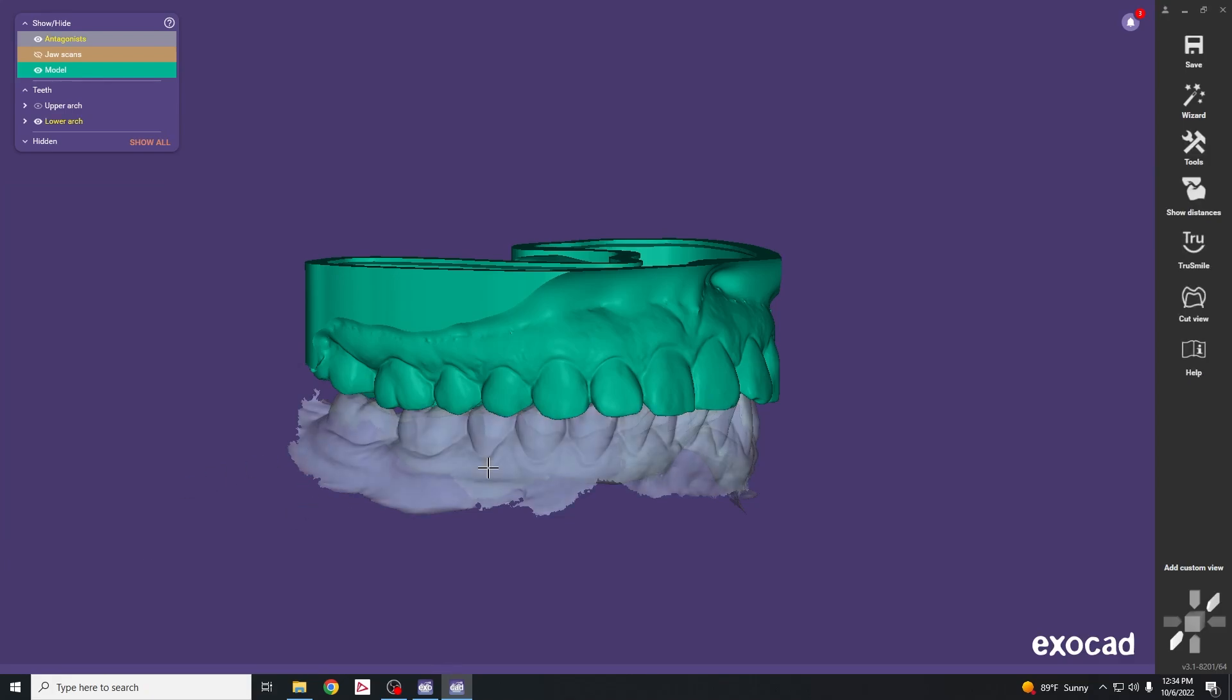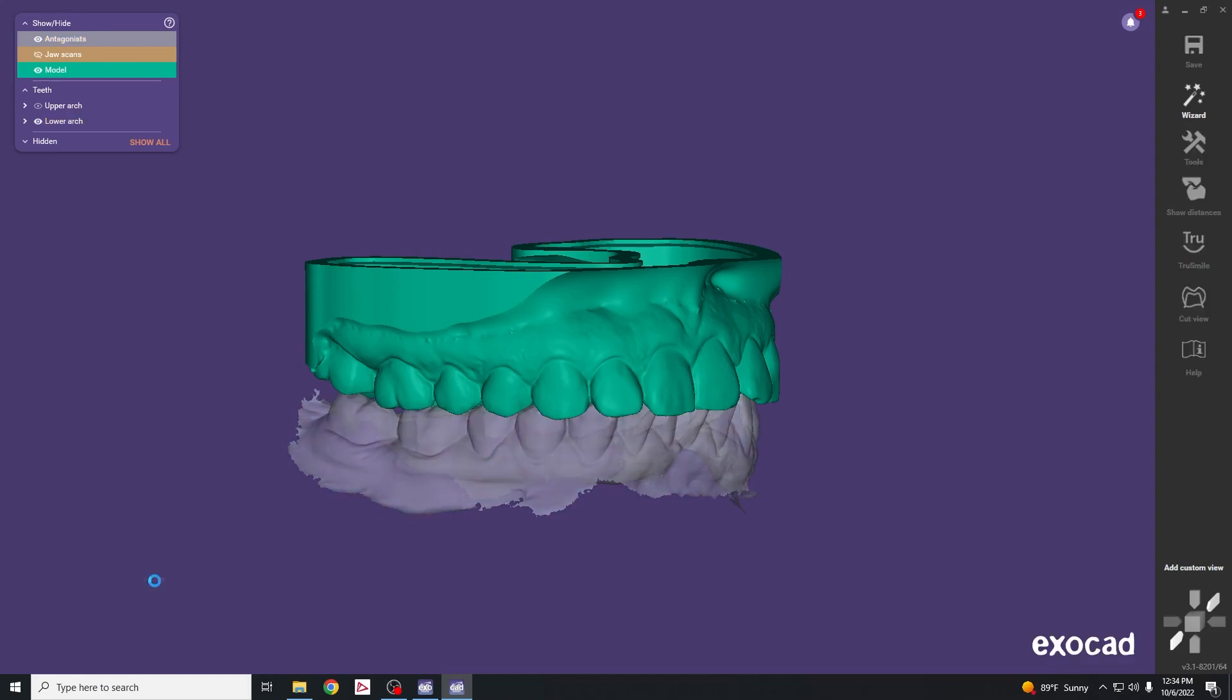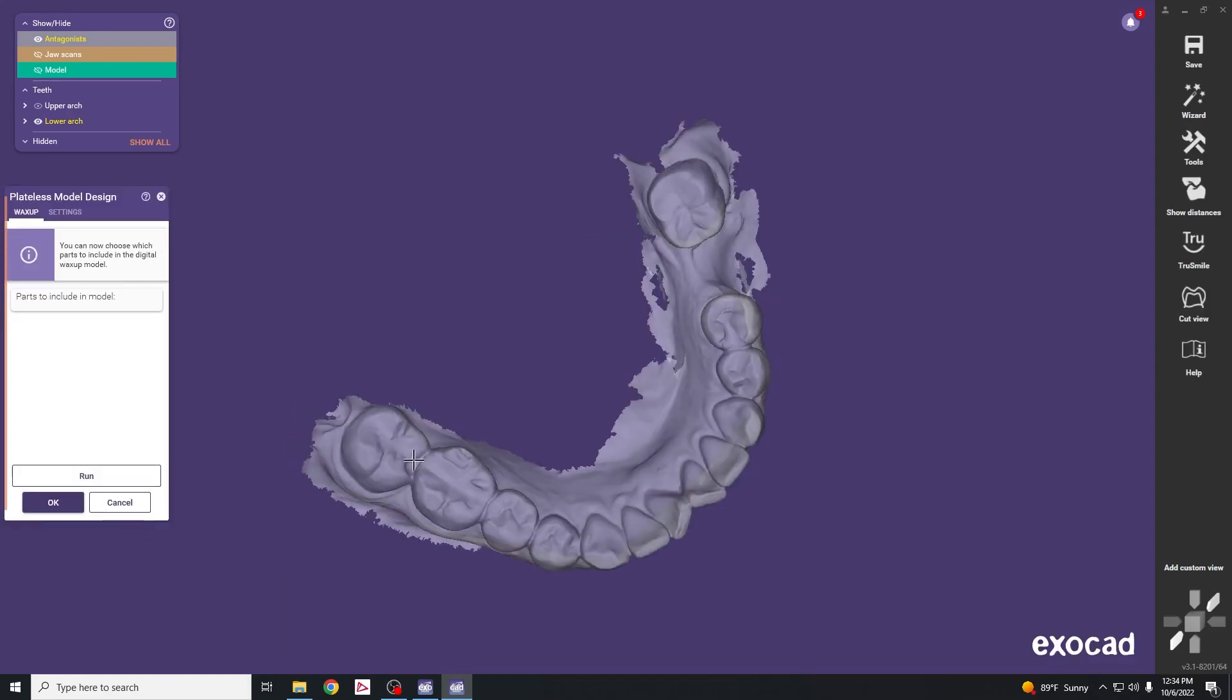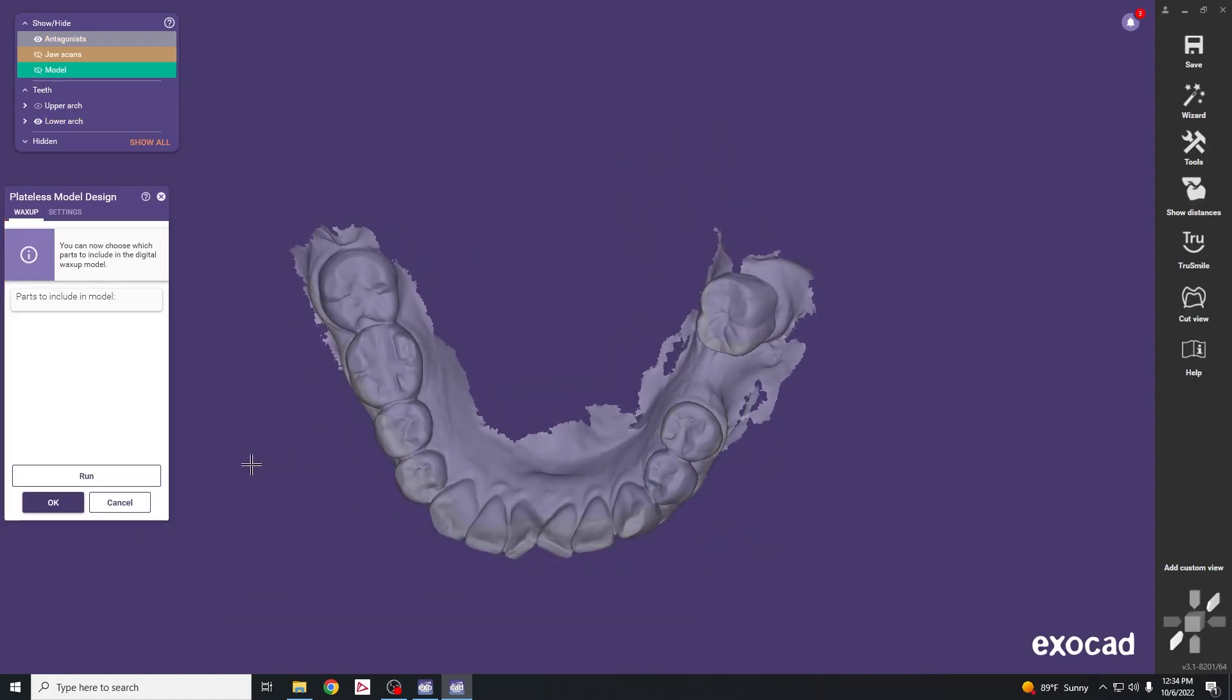Click on the opposing and do the same thing. Click on plateless model design. Now the lower is selected, so hit run and that will add the base to the lower scan.